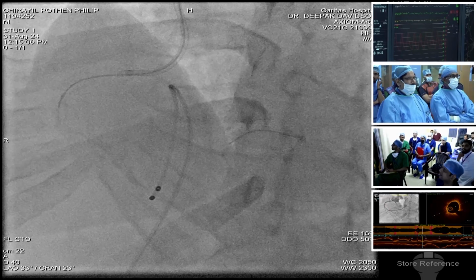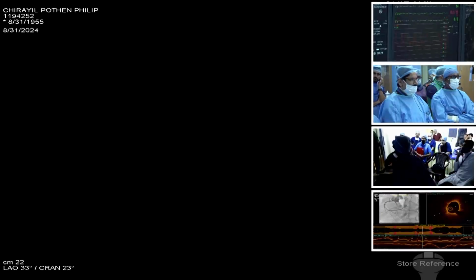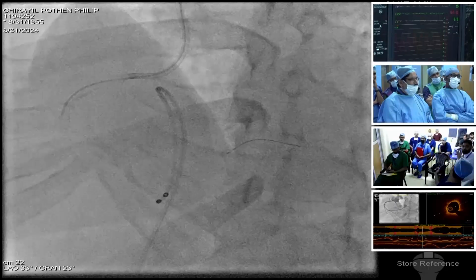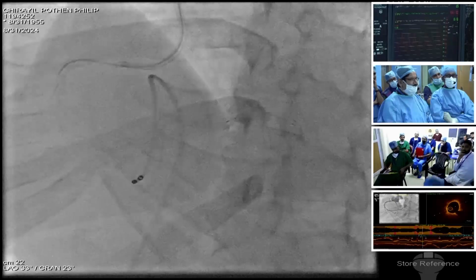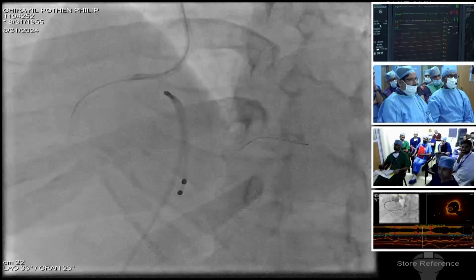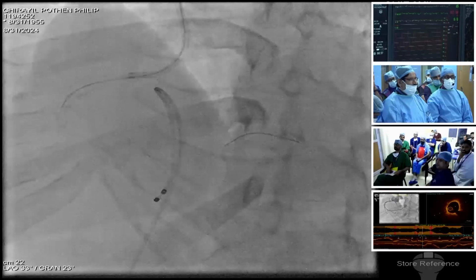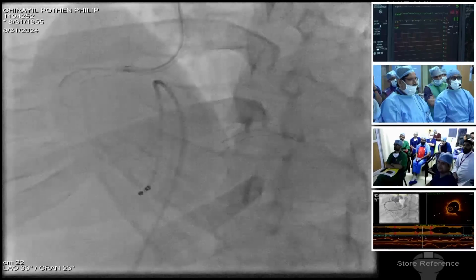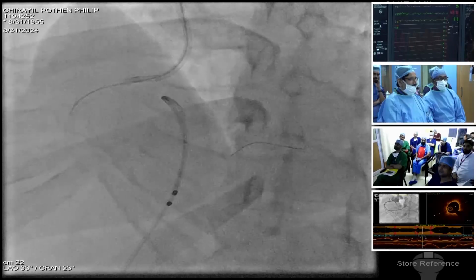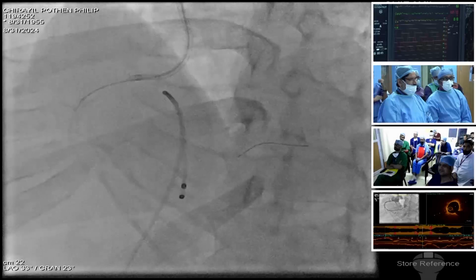Now, once we come back a little more, probably once we come up a little more proximally, then we'll switch over to 120,000 RPM. Yes. And then at 120,000 RPM, we'll go one more round till we are done till the distal end of the calcification. Yes. Then we come out and then go with the OCT catheter.